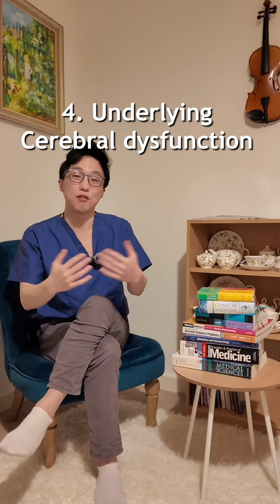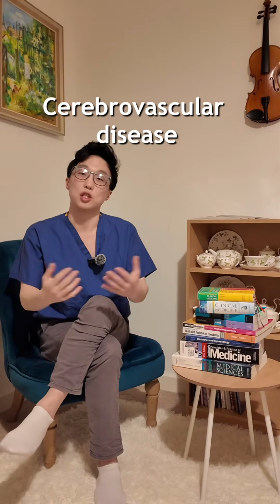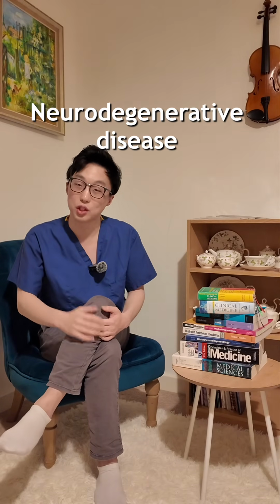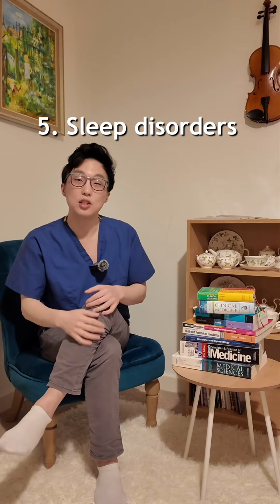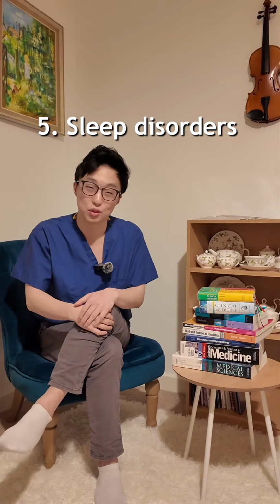Very useful indeed. Fourthly, the EEG can give you a clue as to the underlying cerebral dysfunction, such as cerebral vascular disease, neurodegenerative disease such as prion disease, and a recent stroke, an infarct, or brain tumour. Very helpful in this context. Fifthly, EEGs are used as an adjunct in sleep disorders to help its diagnosis.